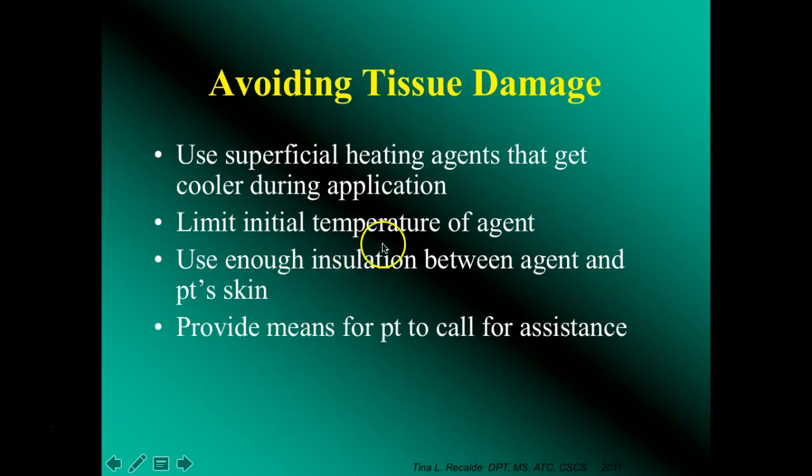Limit the initial temperature of the agent. Use enough insulation between that heat and that patient's skin, and make sure you provide a call bell for assistance for that patient. Make sure that they understand what they're supposed to be feeling, what they're not supposed to be feeling. Do that 5-minute skin check yourself, especially the first couple of times you put something on someone, so you can understand if they need more layers.